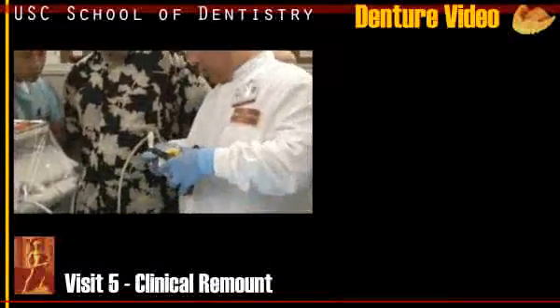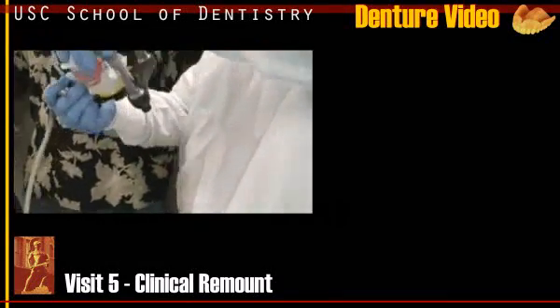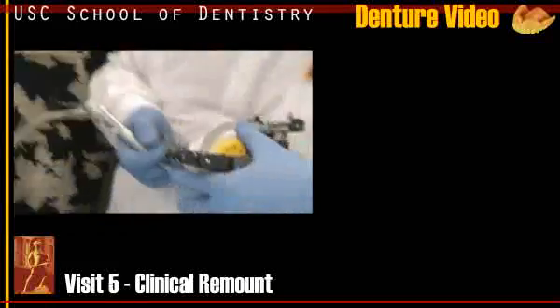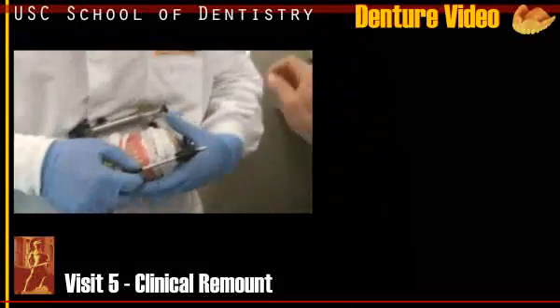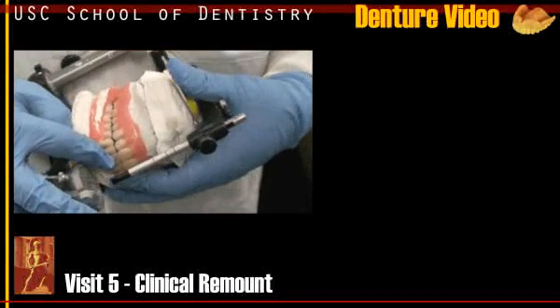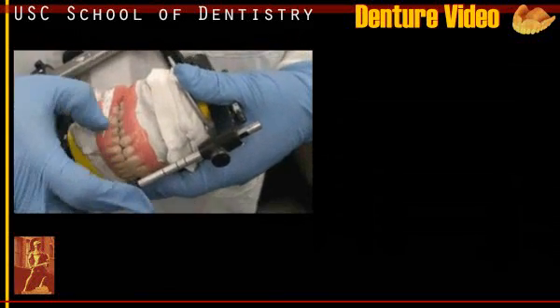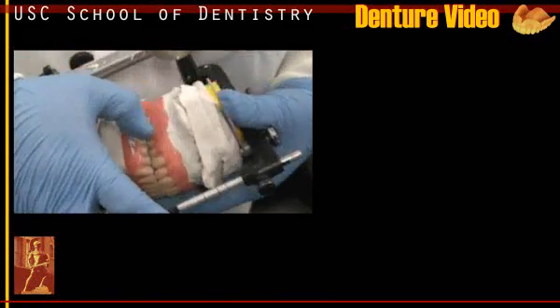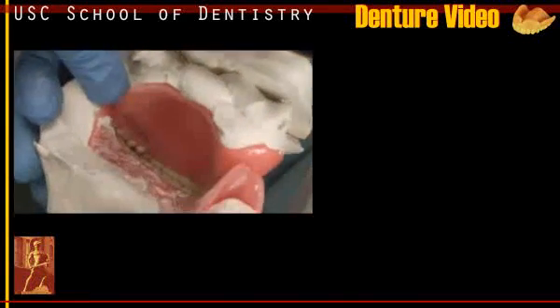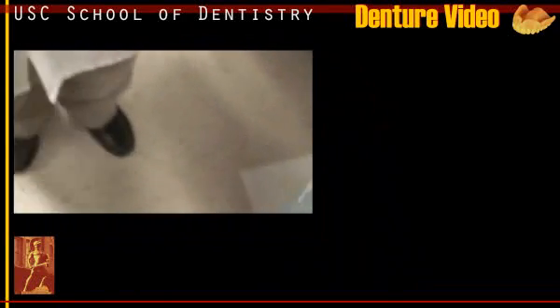Then you have an excursive movement. The anterior touches, posterior touches, and then the other anterior, the posterior touches, right? So it's not that great, but you can hear. Another movement. Anterior touches, posterior touches, and then lingual side are touching. Okay? So there's a tripod. So the denture is stabilizing it when the patient is moving.